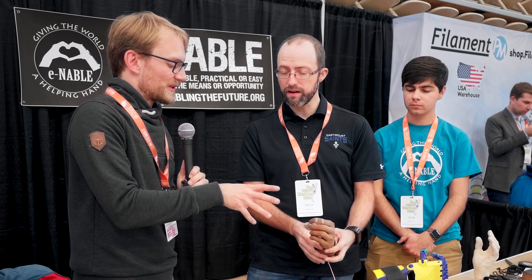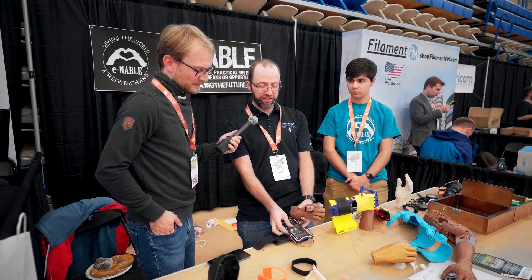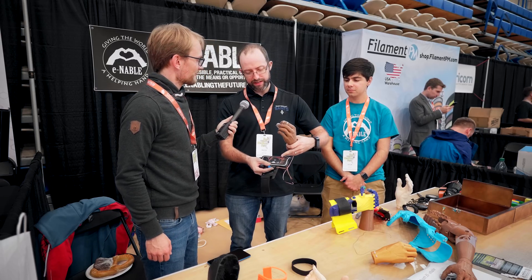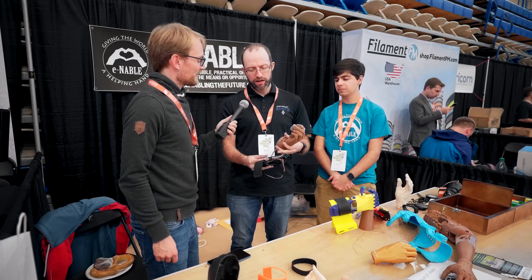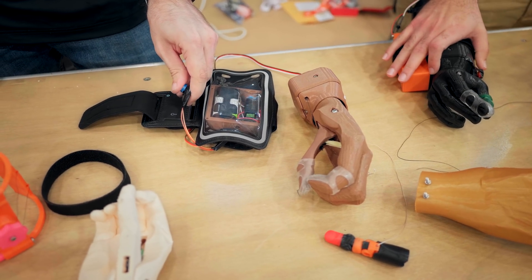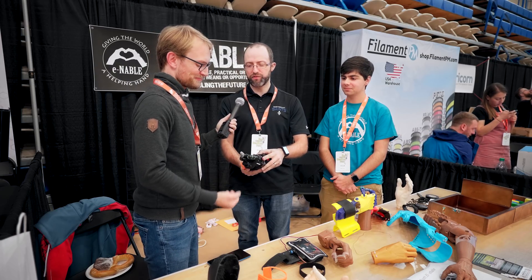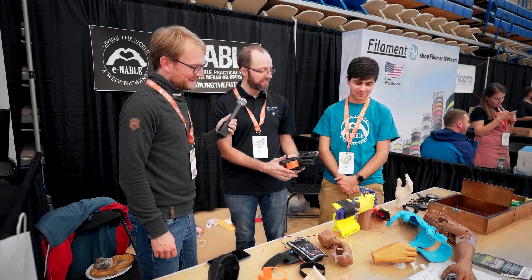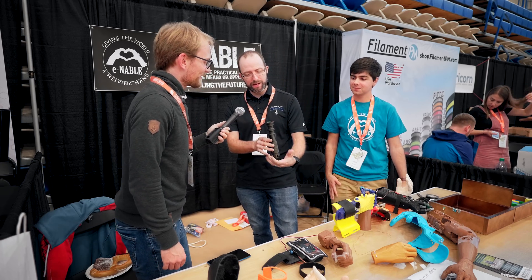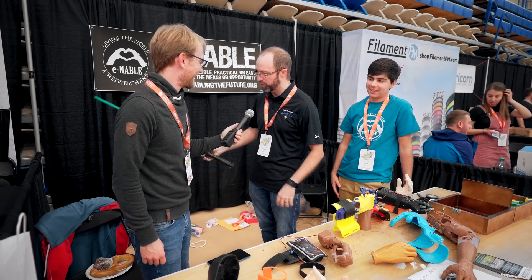And this is one of the motorized ones that you have. How is that controlled? This is a new motorized design — we actually first released it here at this event. All the electronics fit inside of just a like an iPhone jogging case, and then there's a little button. You can put this button anywhere on your user and they can actuate it — push it against their body — and when they push it, there's just a servo in there that pulls it open. It's strong enough that we can actually take the lightsaber, flick it out, and wave it around and fight some Sith or Jedi — whatever we want to do.